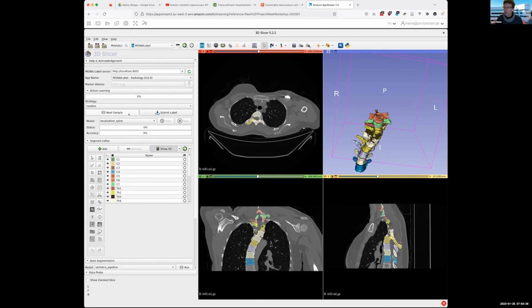Why you only chose a subset? Because I thought, if you download the full data set, the training will not run longer if you have the same stop criterion. It will just see different cases. So I thought that would be a good idea too. Yeah. I think the way MONAI Label is set up, it usually is a fixed number of epochs and iterations, not a stop criterion. Yeah, that's a very good question I haven't gone through.